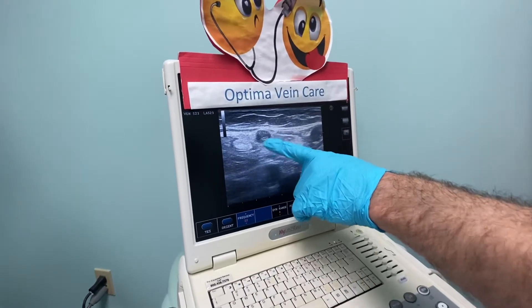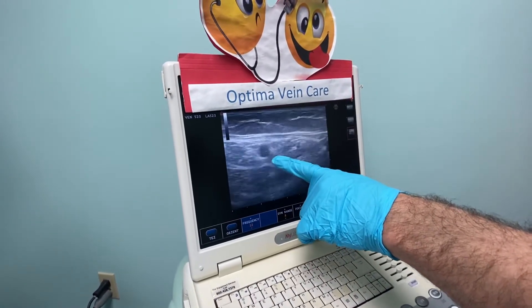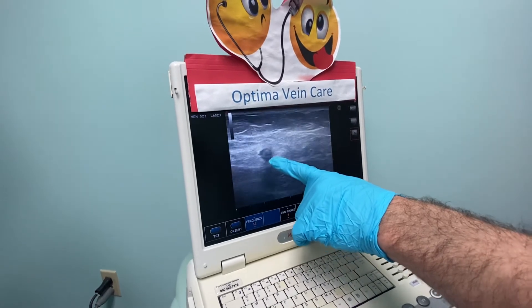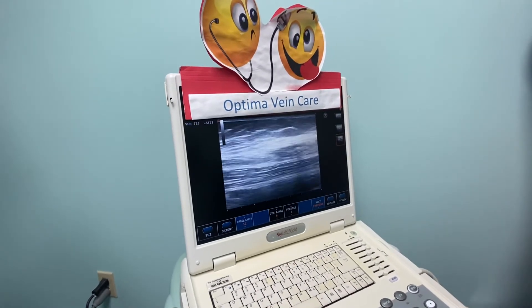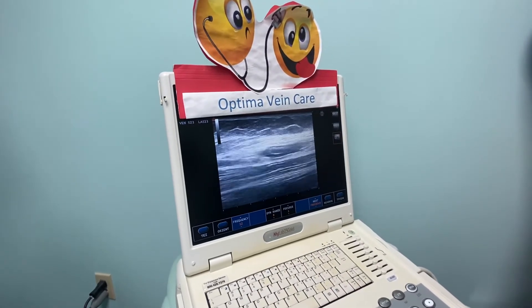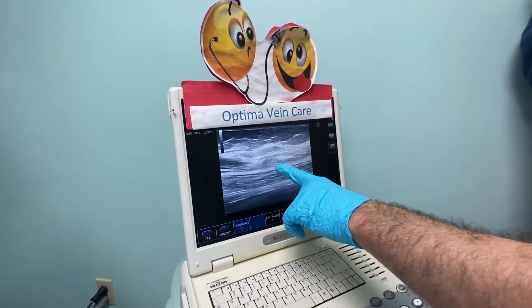You can see the vein itself, and it almost looks kind of bright. As you go down you'll see more or less these kinds of images. You can really see the glue right here in the middle. In a longitudinal view, you'll see the glue going along the inside of the vein, sealing it shut.